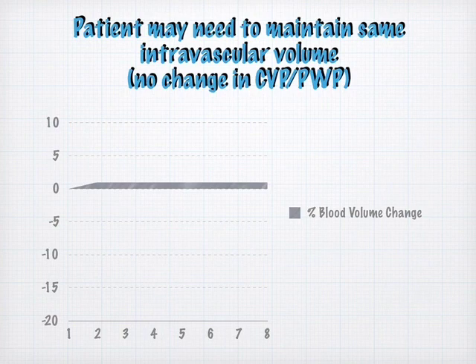I have to admit, I really thought that I was going to end up having to do more dialysis runs, or more ultrafiltration at least, if we let the patients lead the dance, in a sense, with fluid removal. But in all actuality, I think we did fewer dialysis runs, fewer ultrafiltration runs, because we were able to remove the fluid when the patient wanted it off. So sometimes a person might want 5 liters of fluid off, as evidenced by the graph on the Crit-Line, and we would just take it because we could see that they were maintaining their intravascular volume.